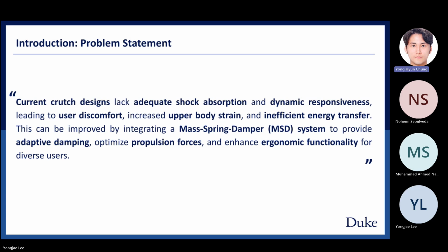Traditional crutches fail to provide sufficient shock absorption and energy efficiency, leading to discomfort and strain for users. Our project seeks to solve this by integrating a mass spring damper system to enhance ergonomics and adaptability for diverse user needs.